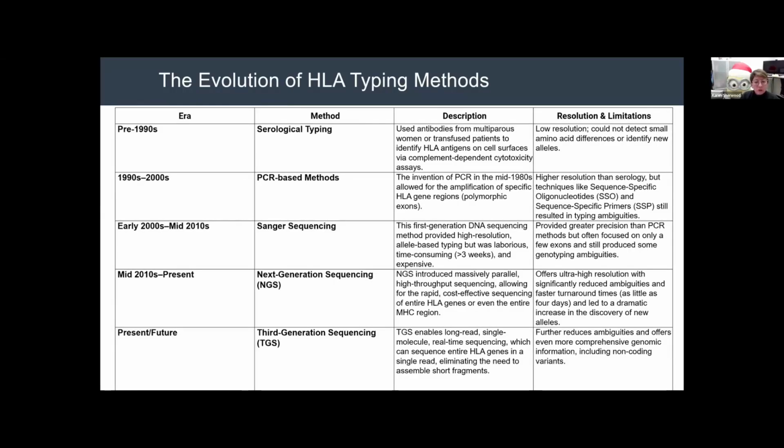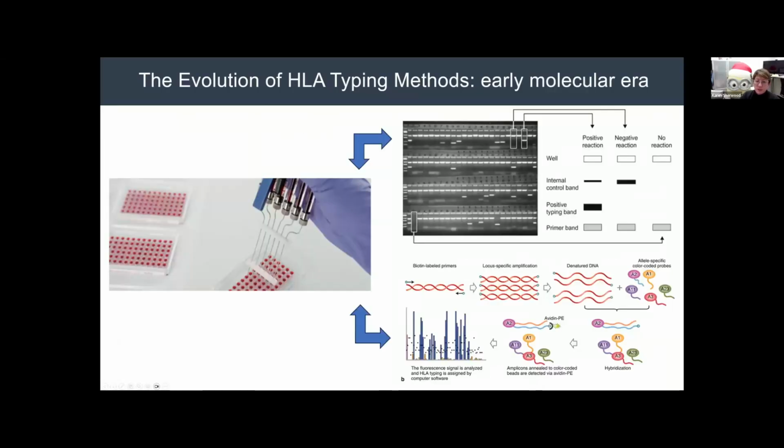As the field moves to long read sequencing as standard, ambiguity reduction will continue, as these methods are particularly valuable for structurally complex loci and for samples where short read methods leave residual ambiguities. Turnaround time and workflow integration has also changed rapidly, from the era of labor-intensive Sanger workflows to now comprehensive, rapid, high-resolution genotyping using long-read platforms.